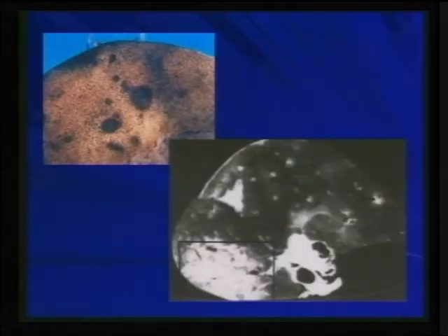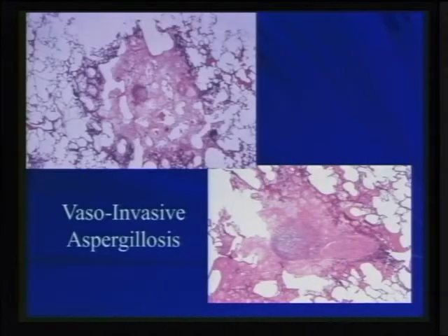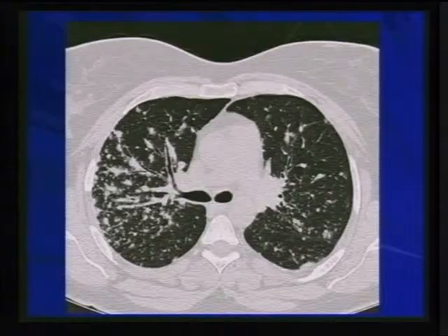The patient passed away, and this is the specimen showing those areas of nodular densities, but then these areas of hemorrhage forming this early halo sign. And again, just showing the nodule on a specimen and then the hemorrhage around it, but also showing the invasive nature of the aspergillosis invading and rupturing the vessel.